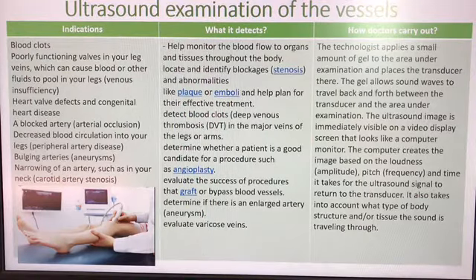Sometimes ultrasound can also be used to aid in the placement of a needle or catheter into a vein or artery to help avoid complications such as bleeding, nerve injury, or pseudoaneurysm. It is also used to evaluate a connection between the artery and the vein, which can be seen in congenital vascular malformations. How do doctors carry this out?